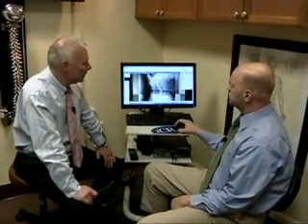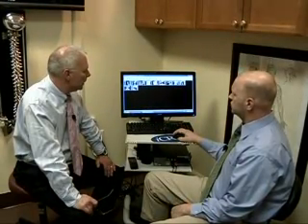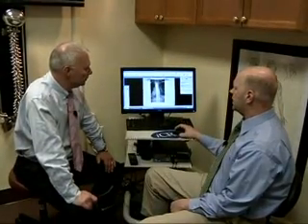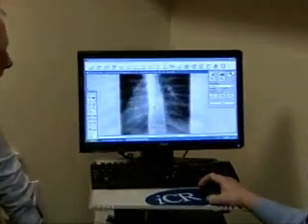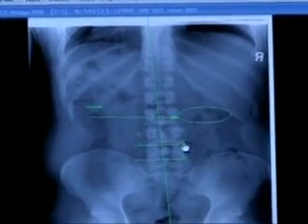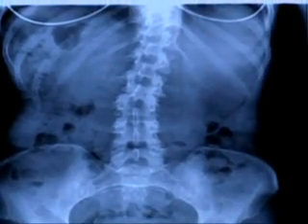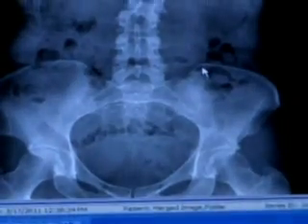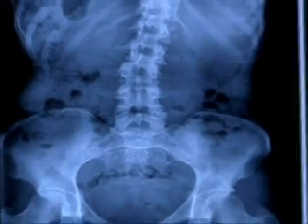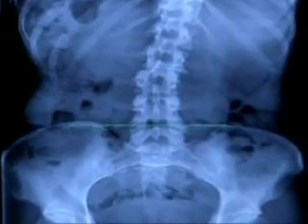Just the ability to manipulate these images has given us such a magnificent toolbox. And again, we can measure angles now, like we were shown before. We were seeing the difference in the heights in images. We can draw and compare hip heights from side to side, so we can tell a patient how much uneven they are, like a leg length difference. We can basically draw a line from here to here, and actually measure that. So we can draw a line from here. We know we're flat because it's even here.